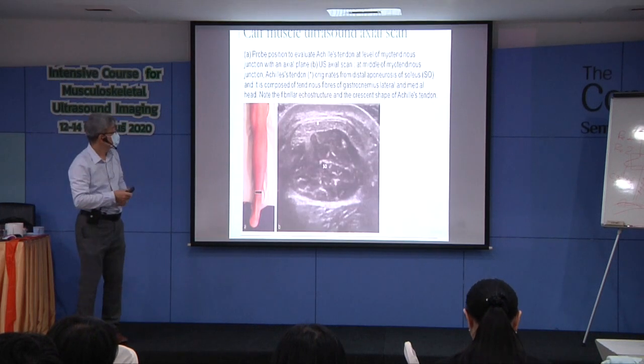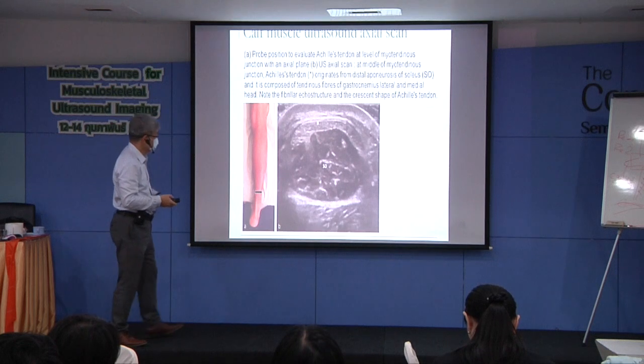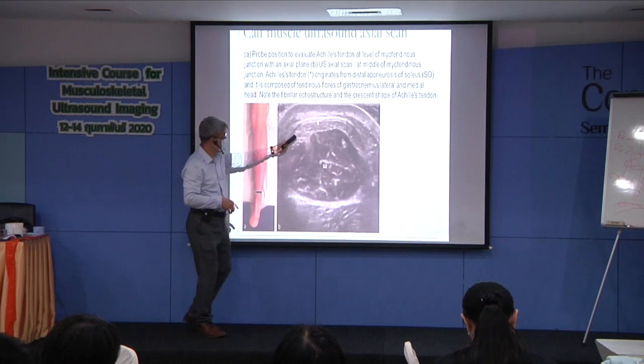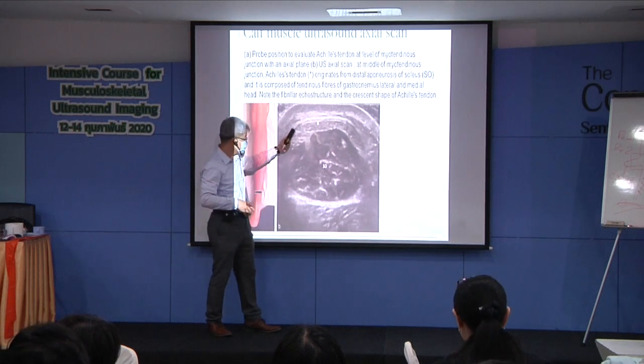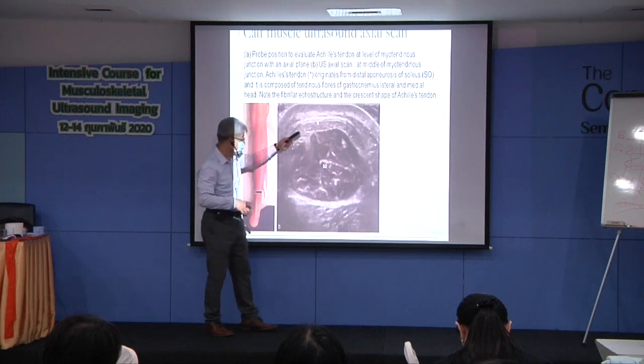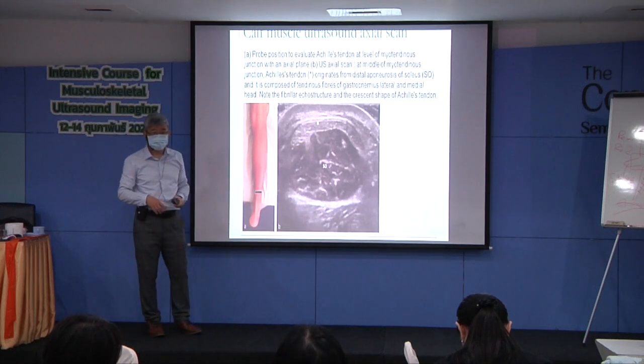Okay, calf muscle. When you lower the probe to the end, you will find the Achilles tendon, transverse view, soleus. Then continue moving to the Achilles tendon.